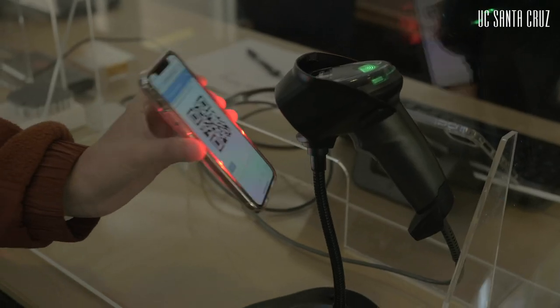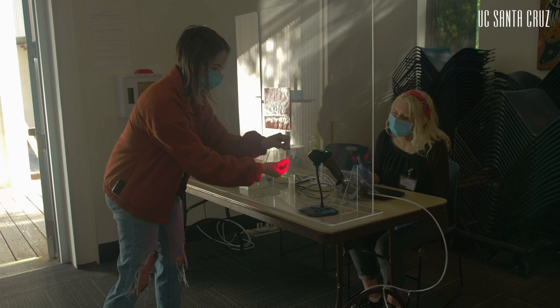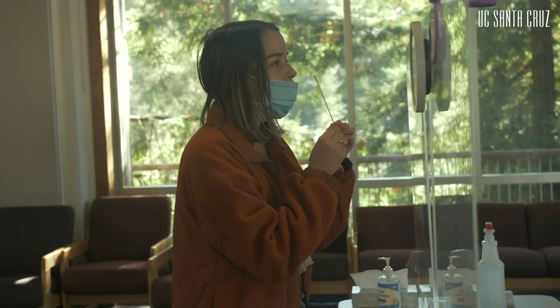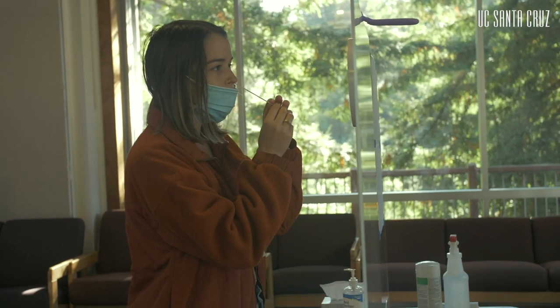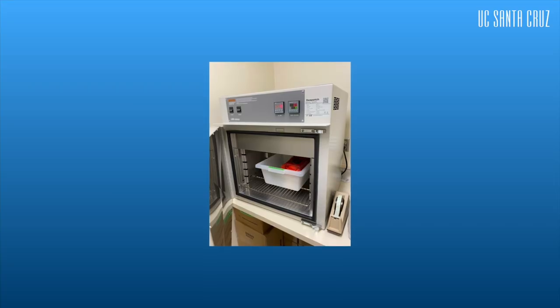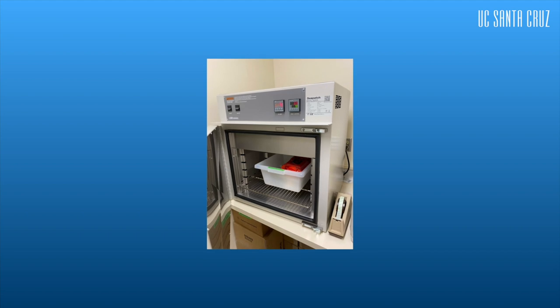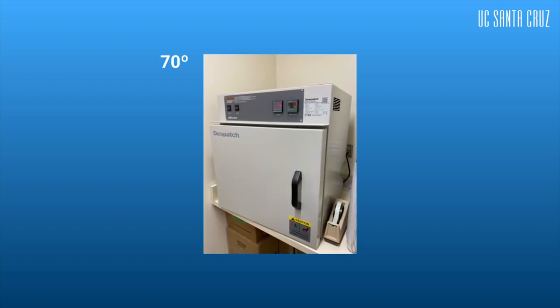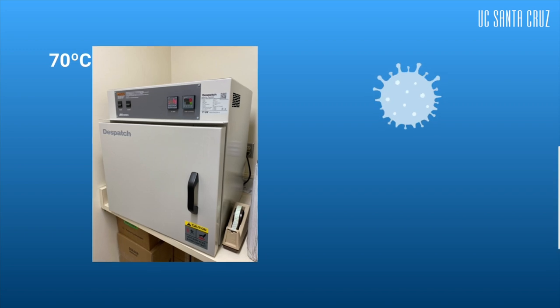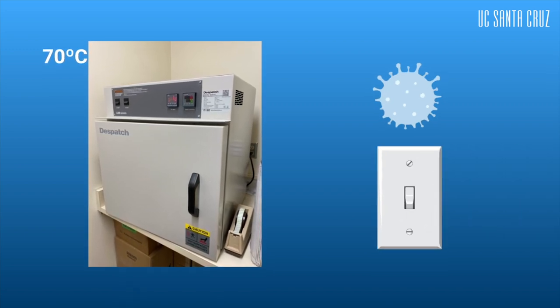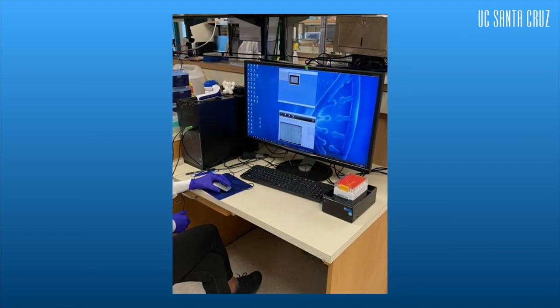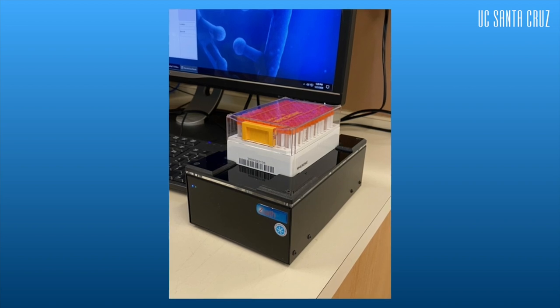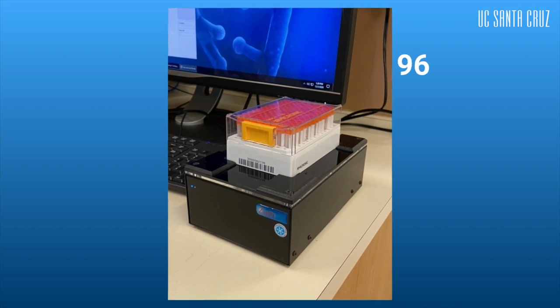The providers take one of these tubes and scan the tube's barcode to register the patient. A swab will then be conducted. They return the kit to us by courier. Once kits arrive back at our campus, they are brought to the lab and sterilized in an oven at 70 degrees Celsius. This is a safety measure designed to ensure that the virus is deactivated and the genomic material is maintained. Once the kits are sterilized, they are inserted into a barcoded rack, which is placed on a scanner, and up to 96 tubes can be scanned all at once.